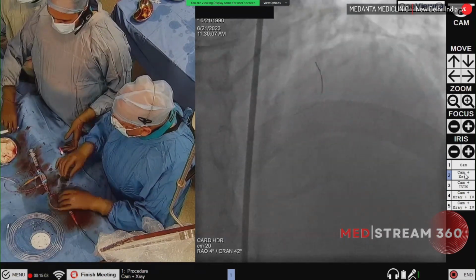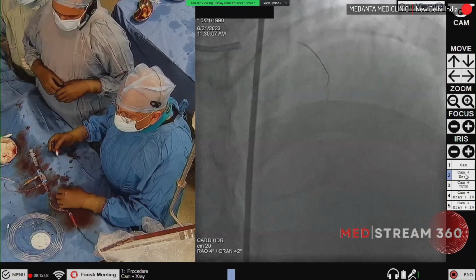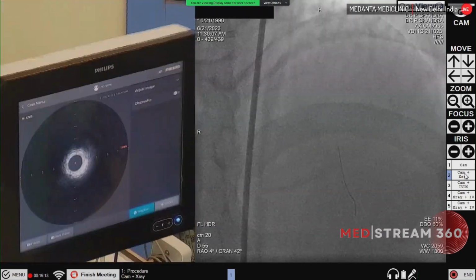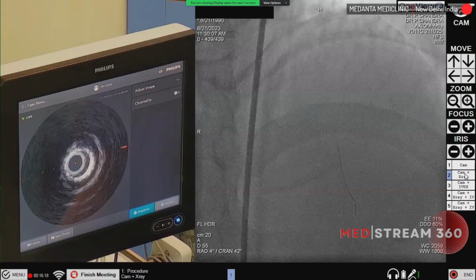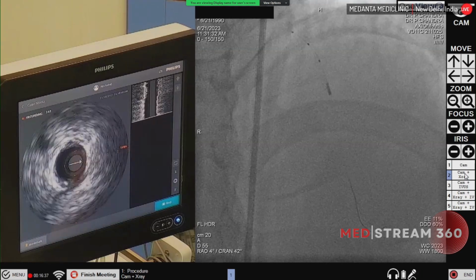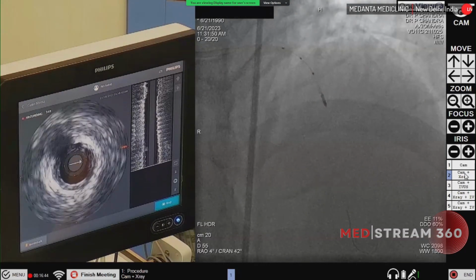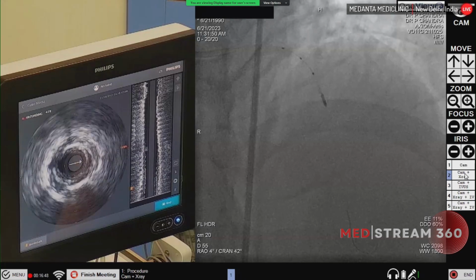What is the situation of this? Where exactly is the lesion here? Do we find a true lesion somewhere or not? Show me the IVUS, please. So let us do an IVUS. This is on the same FFR wire that I'm using for the IVUS. Quite okay, largely free of disease in the segment which is beyond this diagonal. And here you have the diagonal and the septals coming in. Again, the disease doesn't appear to be significant.